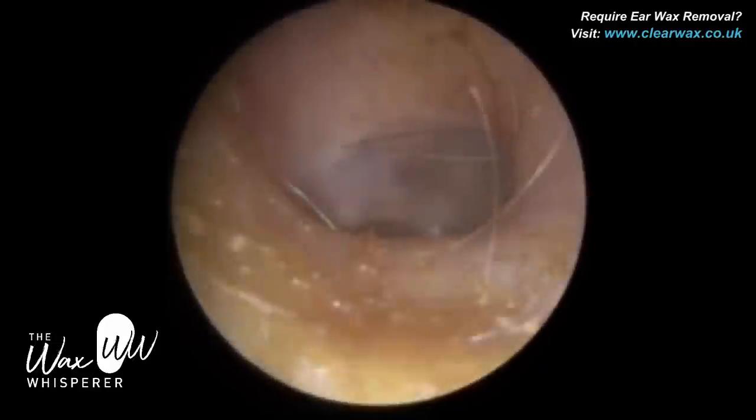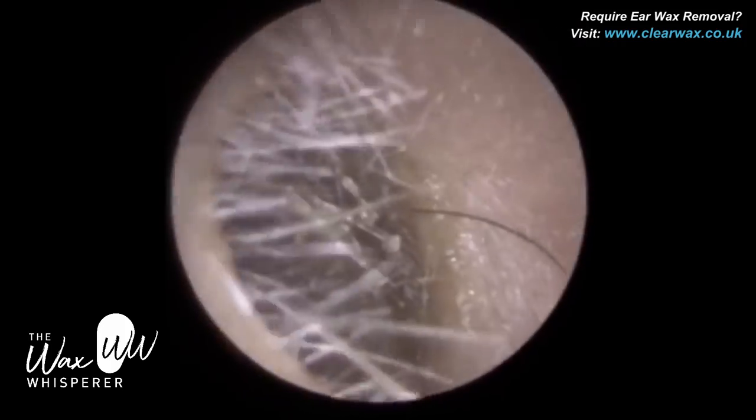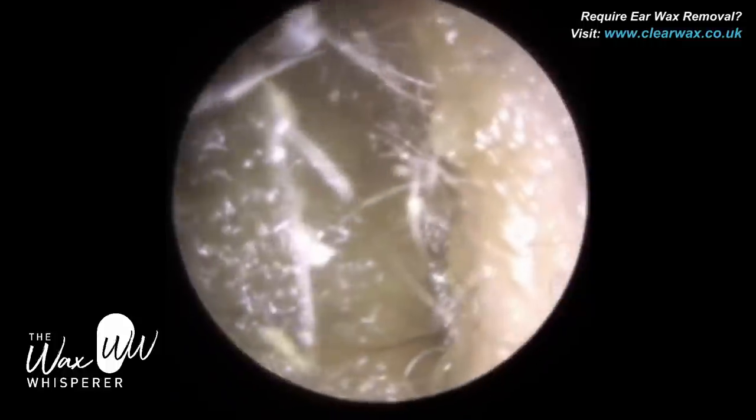Just re-entering the ear — lovely healthy tympanic membrane, eardrum. If you lose hair strands in there, that's fine; it's not going to cause any problems. Just moved over to the right ear.